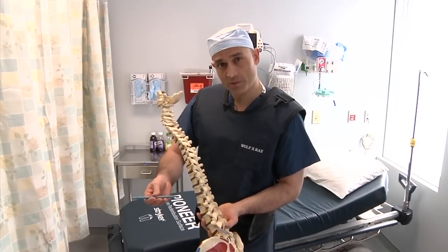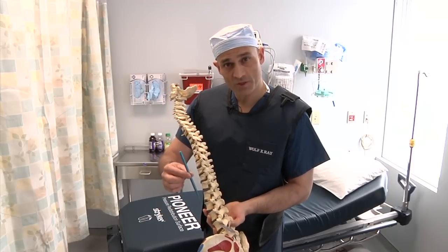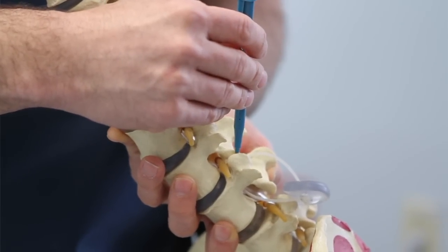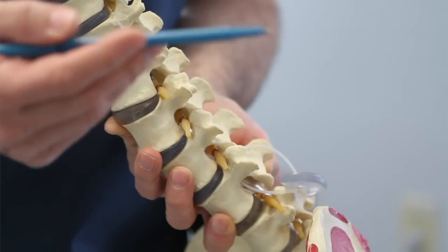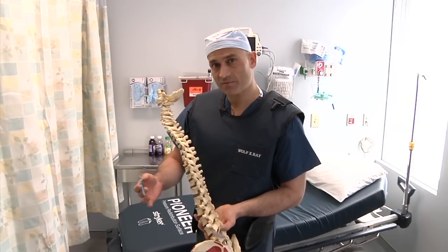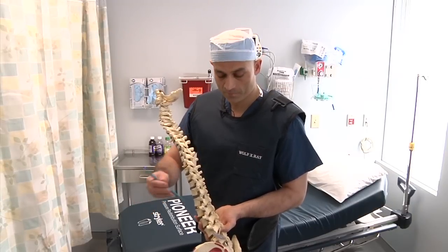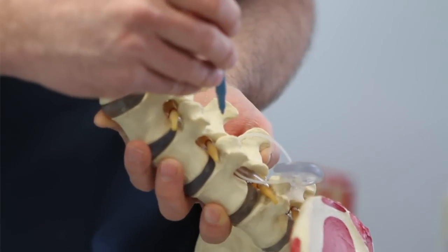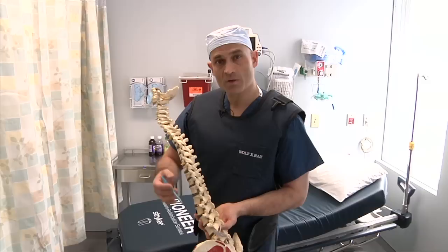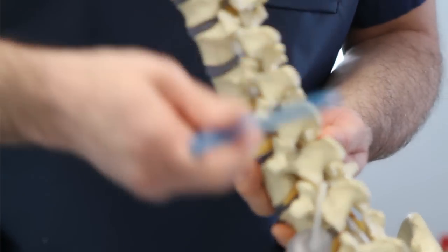The procedure that we're going to carry out today involves the insertion of a very small needle under fluoroscopic guidance into the joint. Once the needle is in the joint, some contrast material is injected to identify and delineate the anatomical regions of the joint. A therapeutic solution is then injected through the needle into the joint, leading to some relief of the patient's back pain.